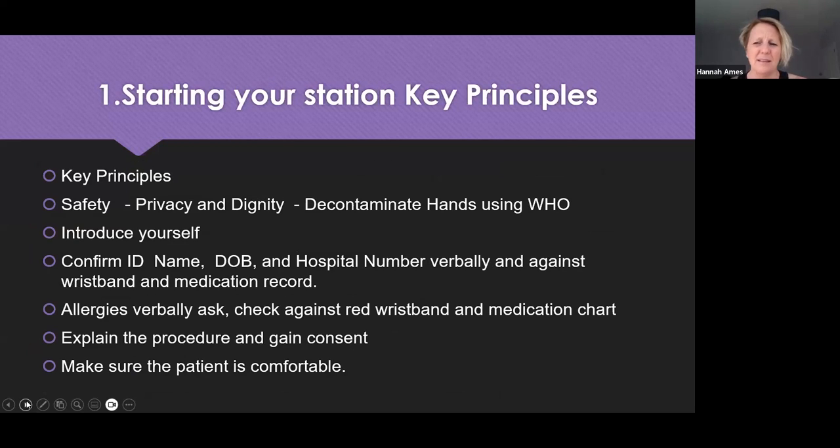So again, every station, key principles: safety, privacy and dignity, decontaminate my hands using the World Health Organization 7 steps. I'm going to introduce myself with hello, my name is, and I'm going to do those ID checks, essential in a station because it is a prescribed medication. So I'm going to ask them to confirm their name and date of birth. I'm going to check this against the hospital band, against my medication chart, okay? And I'm also going to check the hospital number, and I'm going to verbalise that I'm doing that, okay?